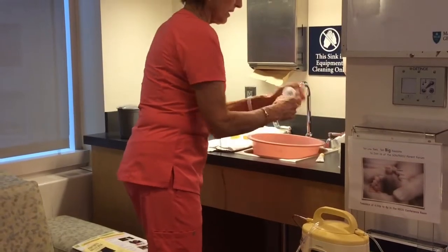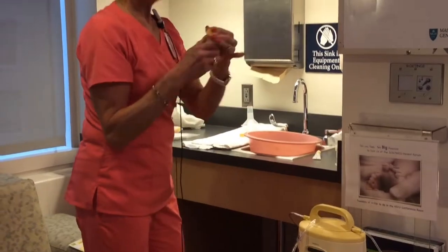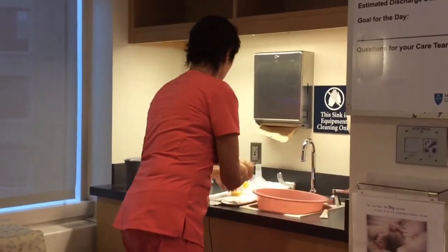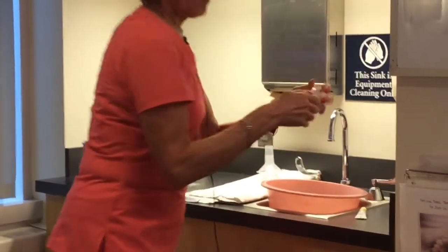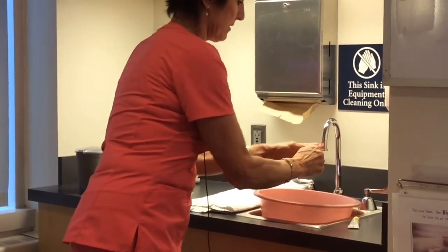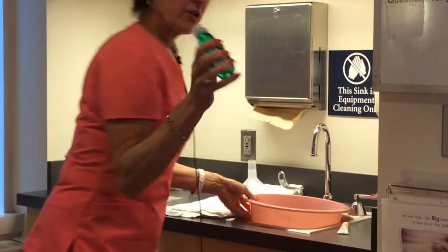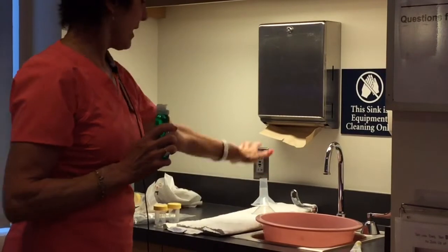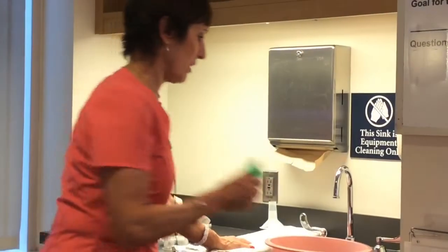Then everything gets pulled apart. The milk gets labeled, dated, and timed with the baby's label. Everything is pulled apart — the yellow disc, the white disc — and everything is washed with hot soap and water, rinsed thoroughly, and placed on a towel to dry. You do not use paper towels to dry.